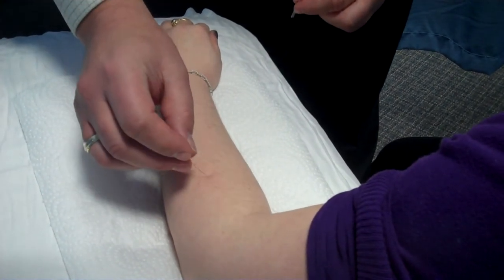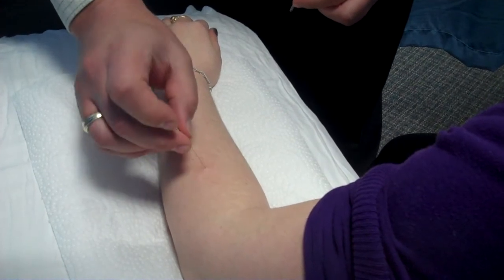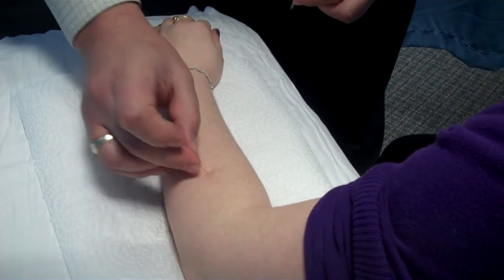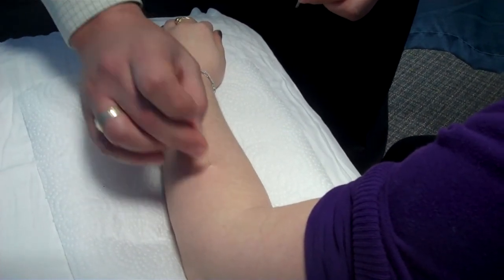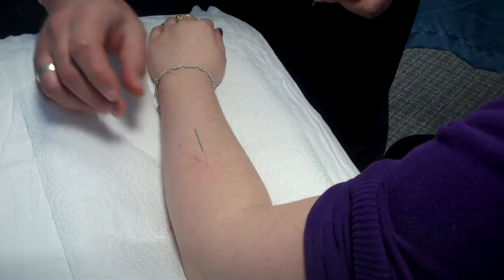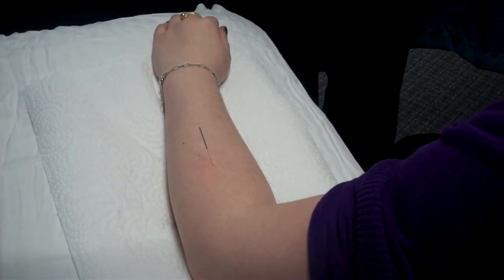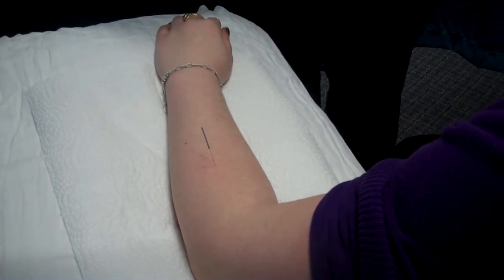I am manipulating the needle, and what I'm looking for is a nice intramuscular twitch. You can see I'm trying to be very aggressive. And there we go — we got a nice intramuscular twitch. At this point, I will leave the needle in for 20 minutes while the patient is relaxing.